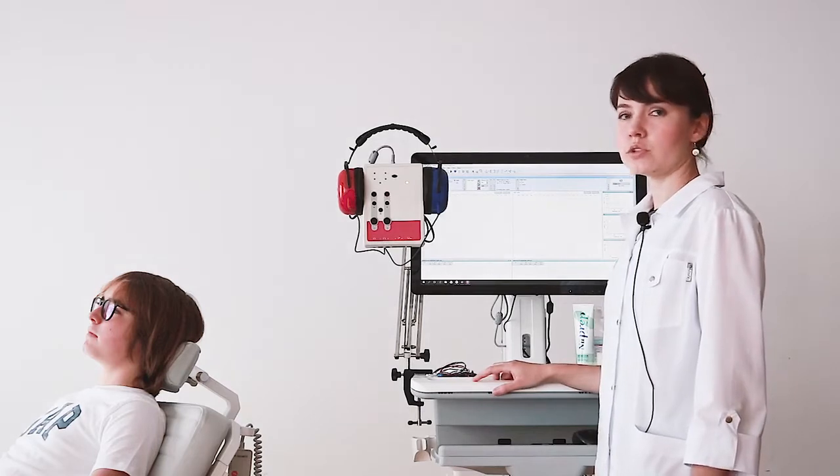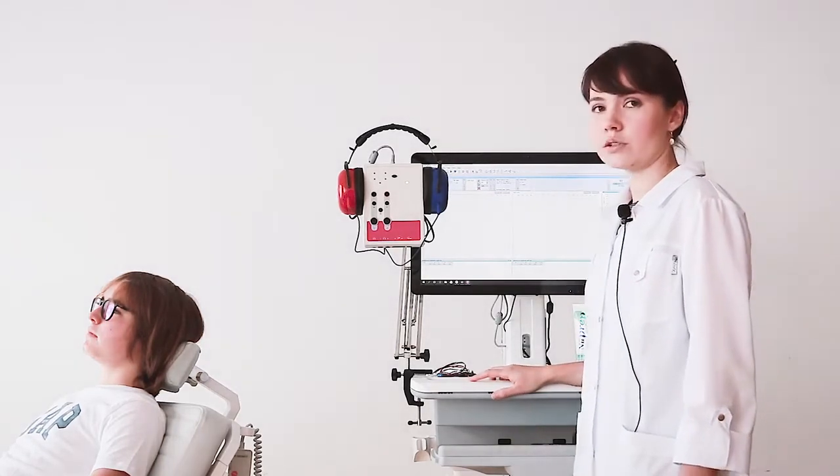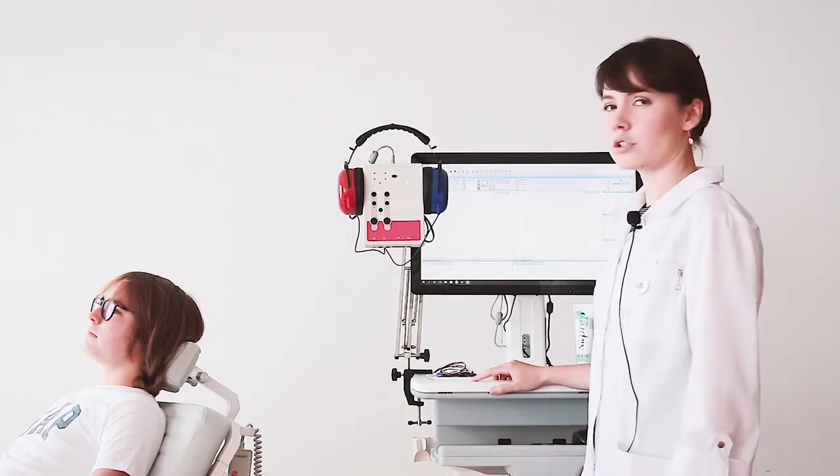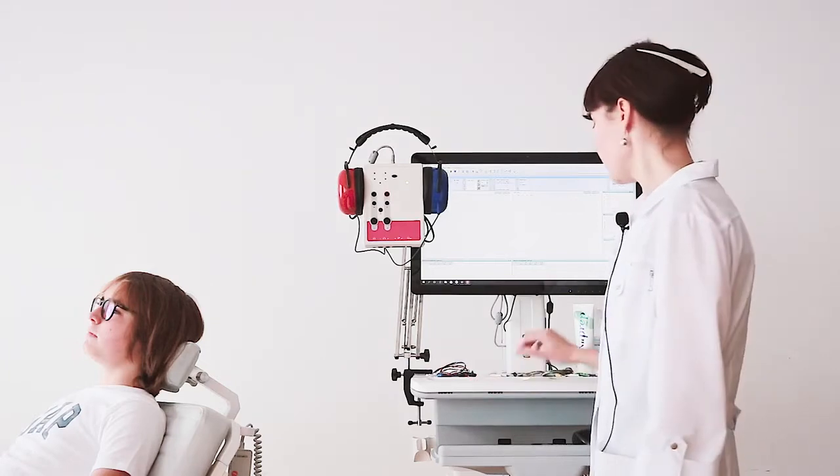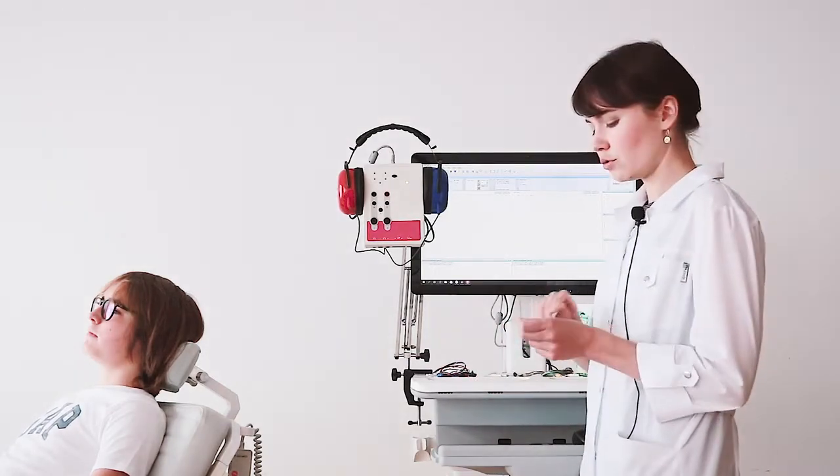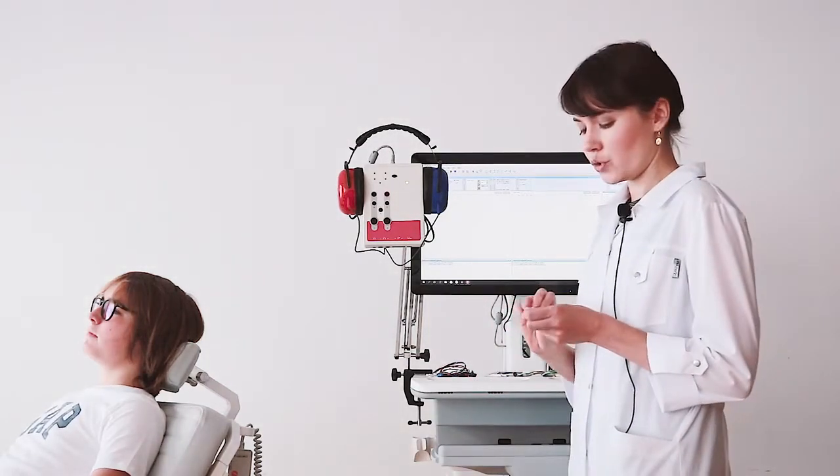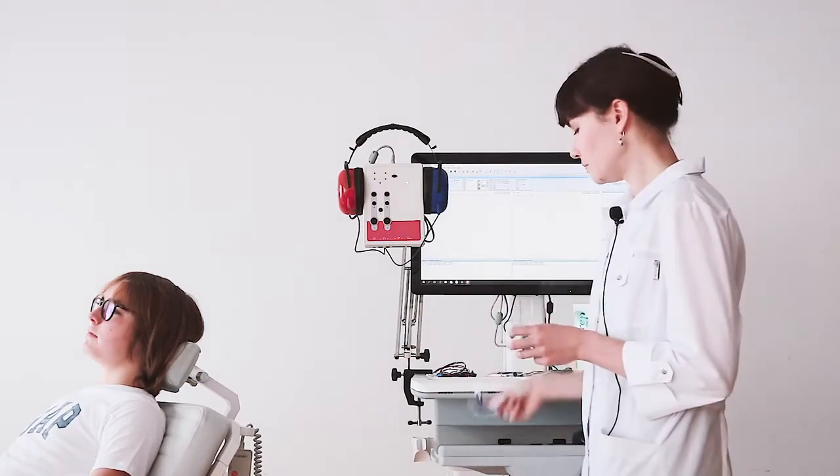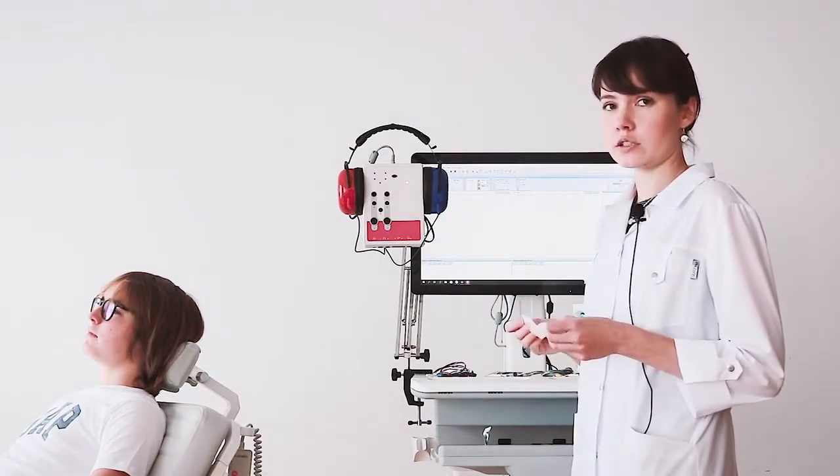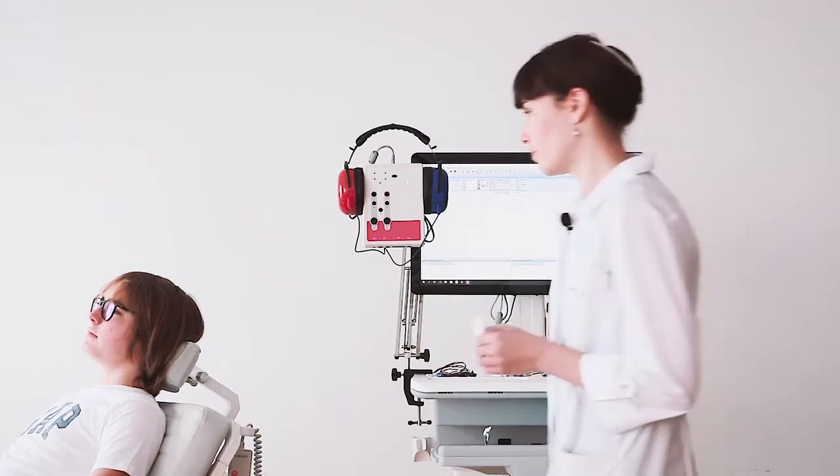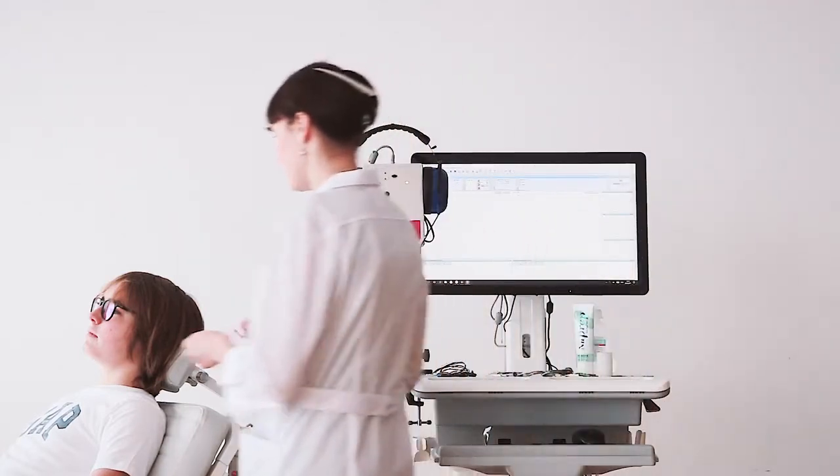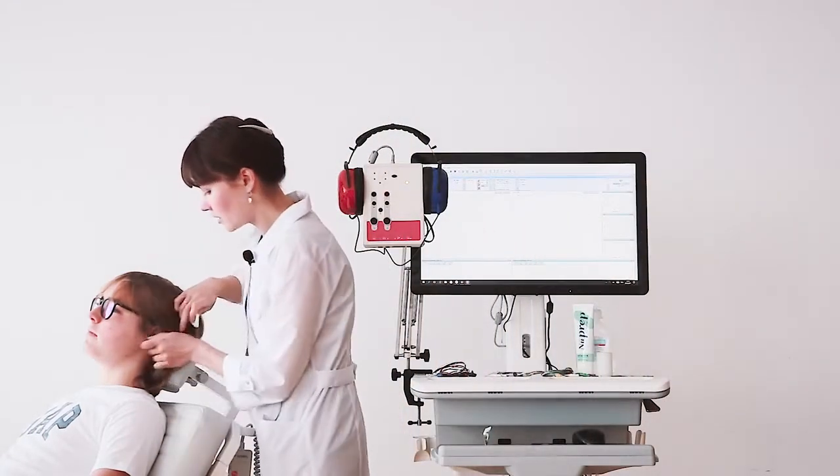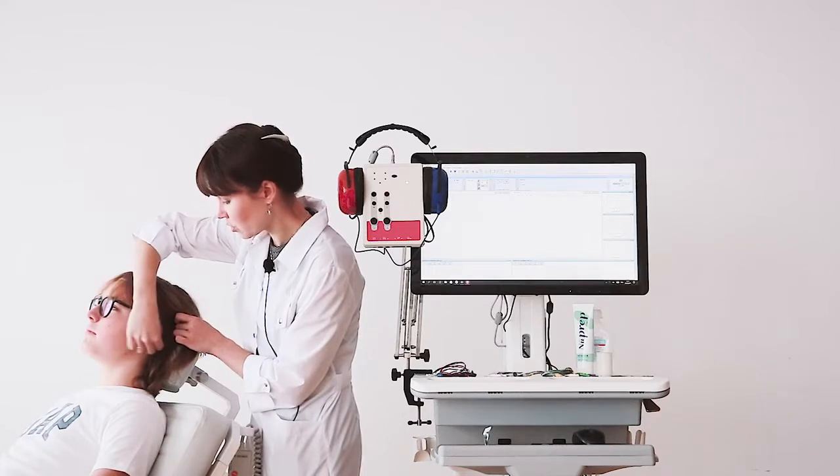We are ready to put the electrodes. Before it, we need to prepare the patient's skin properly. Firstly, we need to degrease the point of electrode position, especially if the skin of our patient is oily.